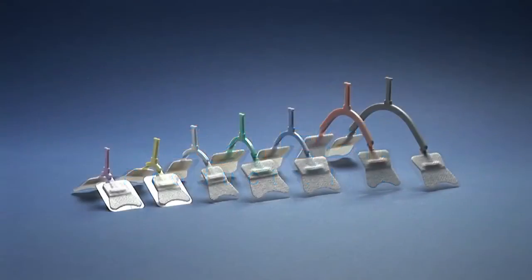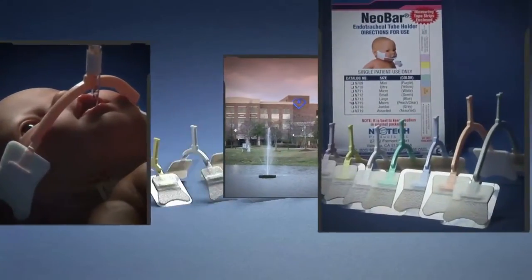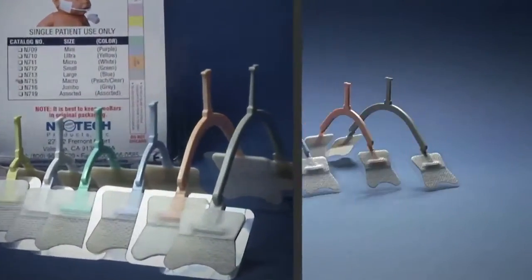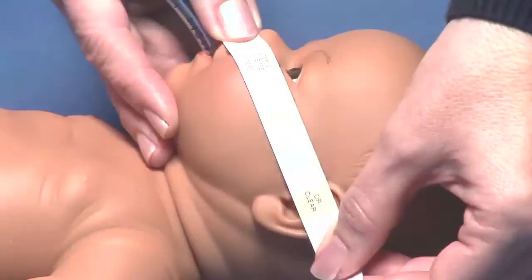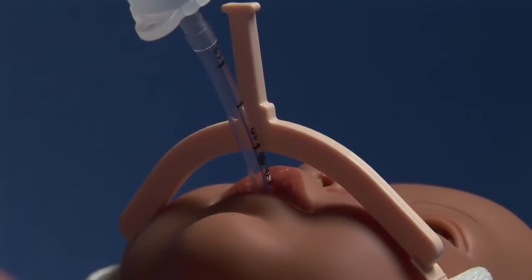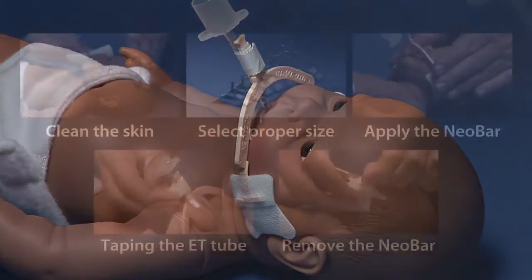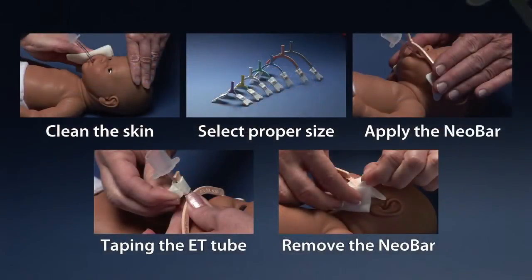The Neobar from Neotech Products has been successfully used to stabilize ET tubes in hospitals around the world for more than a decade. Neobar owes its success to its unparalleled ease of use for securing ET tubes for neonatal to pediatric size patients. Here are a few key steps you should follow to achieve the best success with the Neobar.